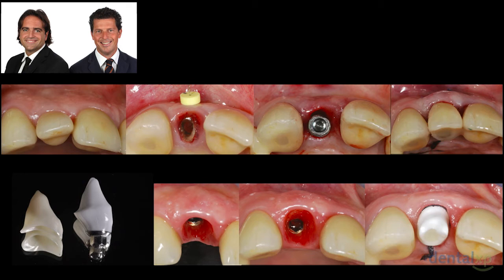And here we have a zirconia abutment with a titanium base produced thanks to the CAD/CAM technologies. And we are moving forward till the end of the restoration without forgetting every detail of our treatment plans. Cementation is very important, so we need to pay attention also in this kind of protocols. During the cementation phase, when it's possible, put a retraction cord that will help you to remove easily the residual cement, because residual cement can lead to peri-implantitis over time.